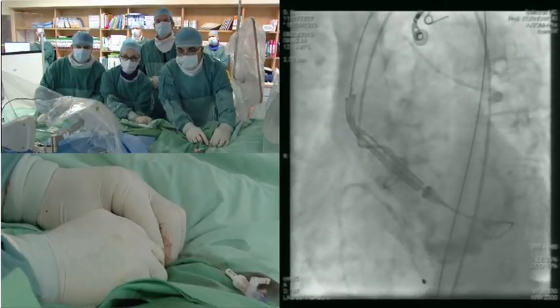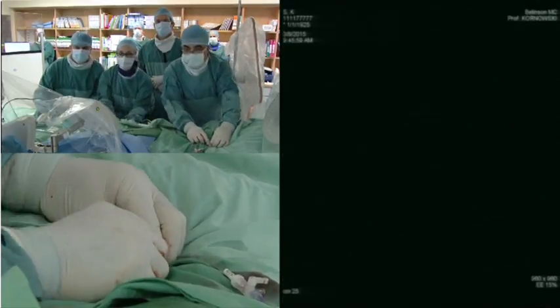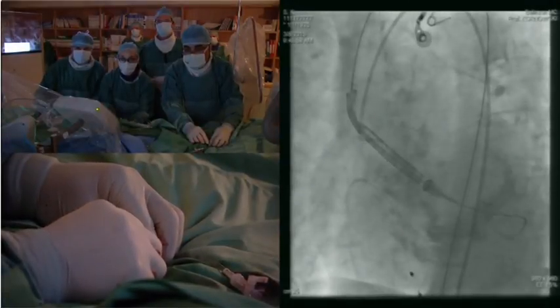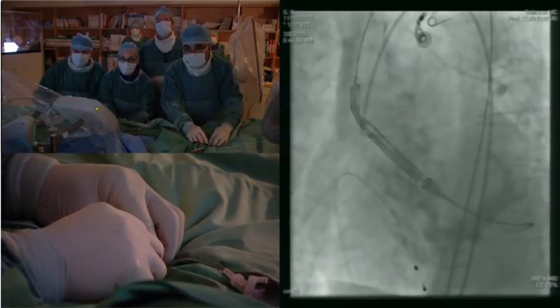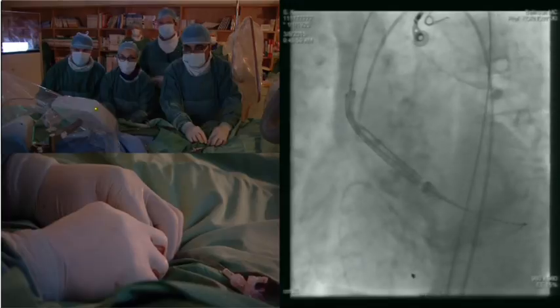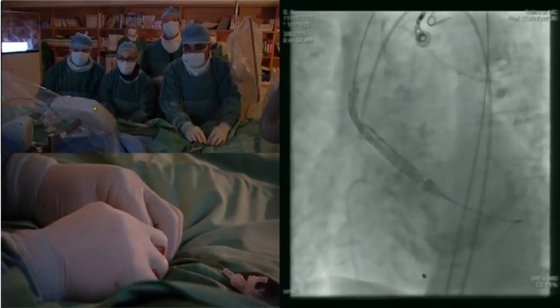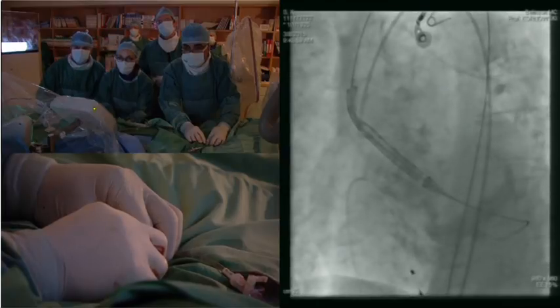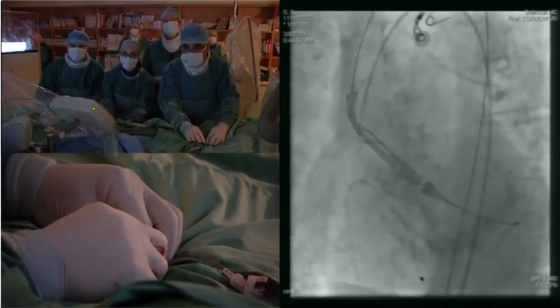Okay. We're a few millimeters below the annulus, and we can start doing this here. Yes. Maybe we can push a little bit on the wire, just a little bit. This is what I'm doing. Okay. Now we can start. Are you going to use the Pion system to know the alignment and then implantation? We are going to start the implantation right now.